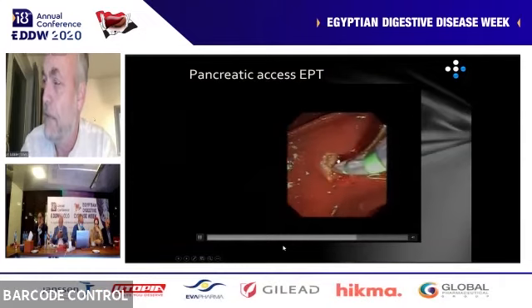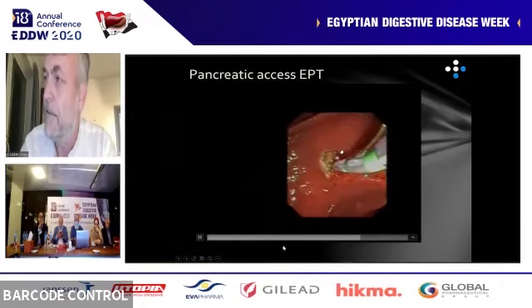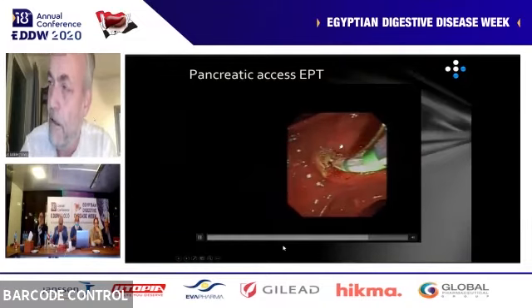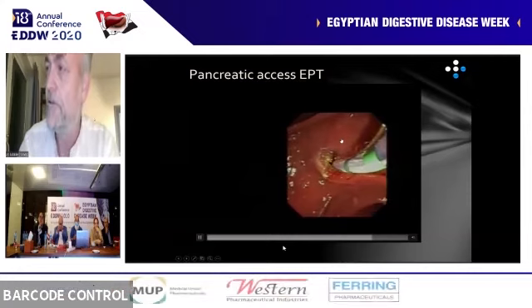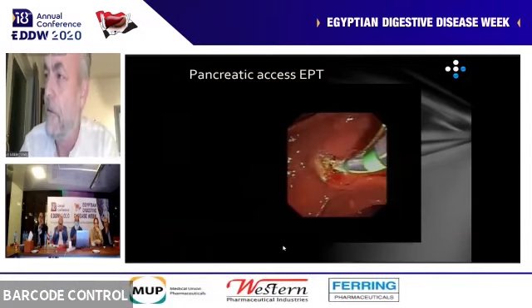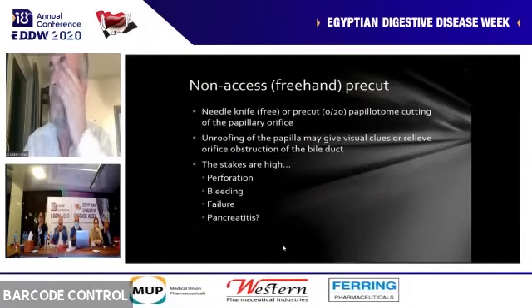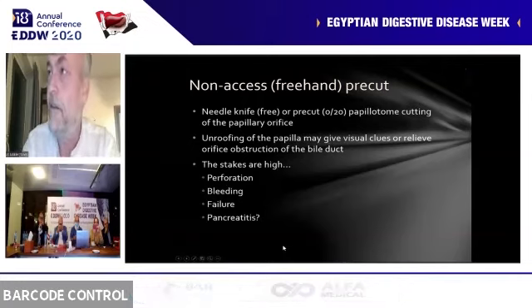So for me, a sphincterotomy over a pancreatic wire is by far superior to a freehand pre-cut. But sometimes you don't get into the pancreas, you don't get anywhere, and then this is your only option, obviously.